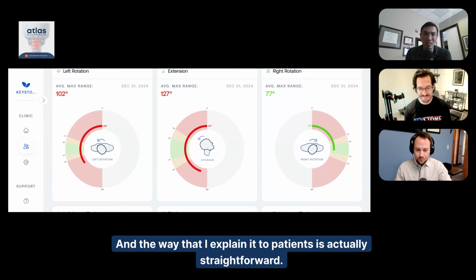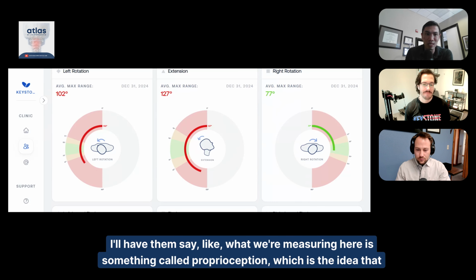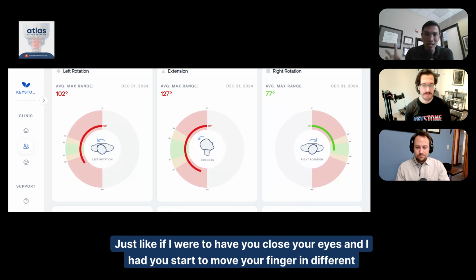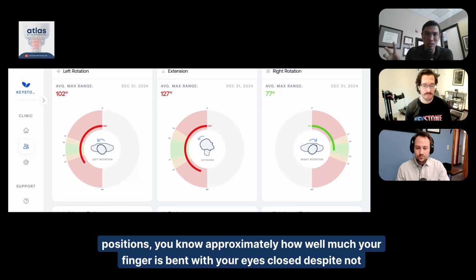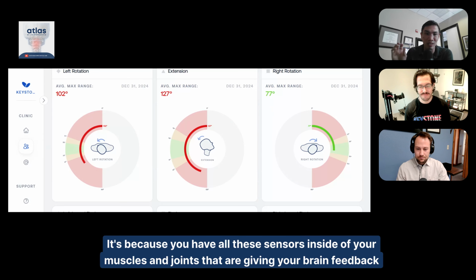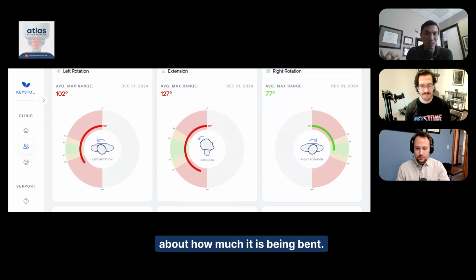The way that I explain it to patients is actually straightforward. I'll say that what we're measuring here is something called proprioception, which is the idea that our brain knows what our joints are doing at any given time. Just like if I were to have you close your eyes and I had you start to move your finger in different positions, you know approximately how much your finger is bent with your eyes closed, despite not seeing what it looks like. It's because you have all these sensors inside of your muscles and joints that are giving your brain feedback about how much it is being bent. Same thing with this.